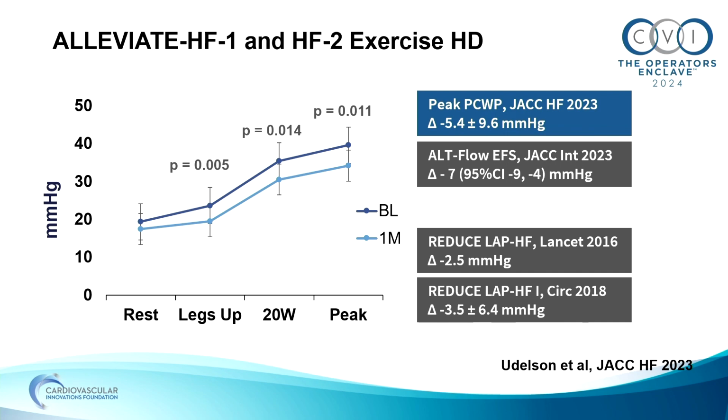So they're all doing what they're supposed to do in a way, but I think what you see here is that the procedures that do not impact the atrial septum seem to have larger improvements in exercise wedge pressure than those that have a septal implant.